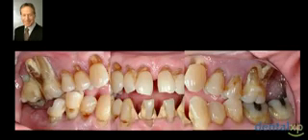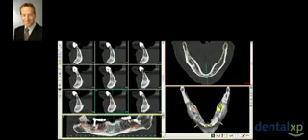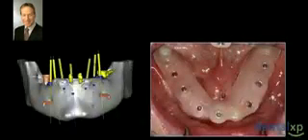Now, periodontal disease does still exist in the United States, but this is probably the only advanced case that I've seen in a relatively long period of time. Well, where are we going to go in managing this particular patient? This is the patient that had the artifact as a result of the implant placed on the lower right side because we were going to place a provisional restoration for this patient. And you can see 2 teeth, a molar, and the implant are going to support the provisional restoration.